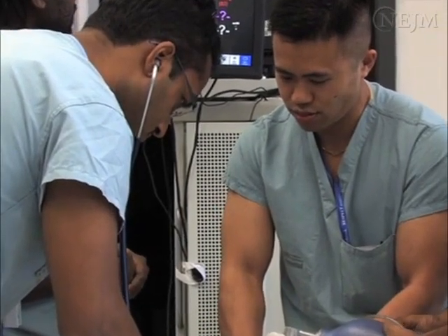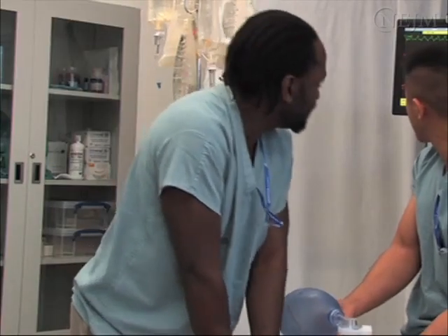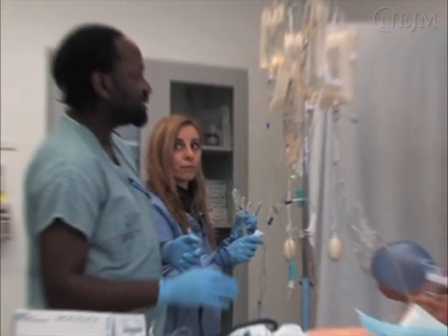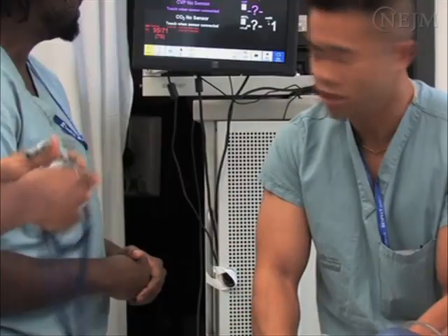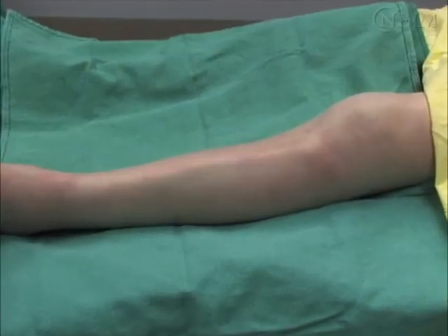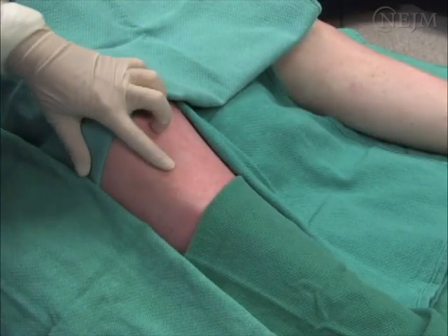Obtaining intraosseous access is an emergency procedure. Consequently, it is rarely possible to obtain informed consent before performing the procedure. If possible, explain the risks and benefits of the procedure to the patient or the next of kin. Otherwise, proceed with insertion. When a mechanical device is used, the proximal tibia is the preferred site in adults.